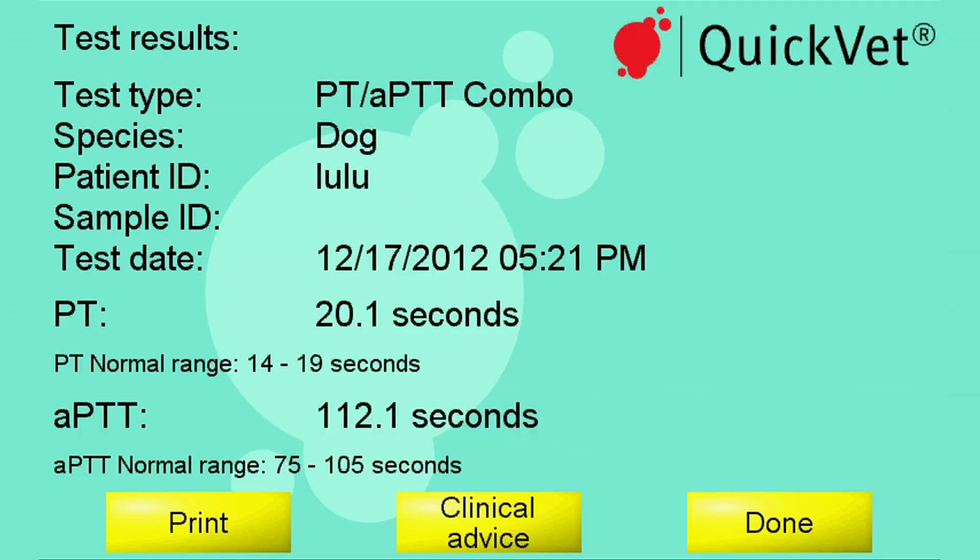The results are ready to view on the display. On the screen you can read not only the coagulation time but also the normal range for PT and APTT. This enables the user to determine if there is a coagulation issue.